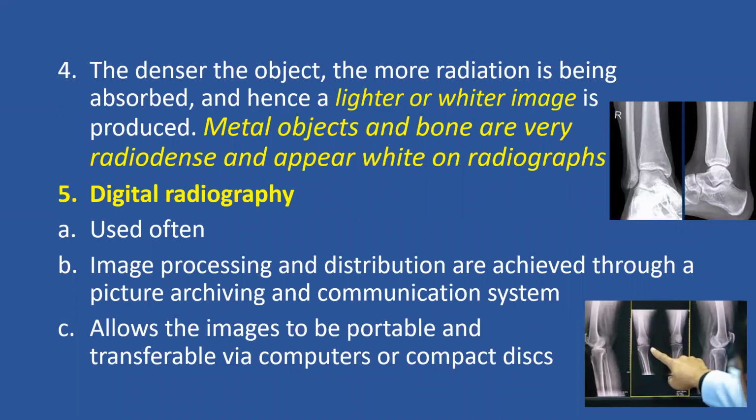If you look at this right-hand slide below, you see a finger pointing to an X-ray on a viewing box. We have these X-rays which are transferable. It's important for education. It's important for treatment and advice. It's recorded on computers. This lecture has many X-rays. It's recorded on computers and we can transmit it to everybody.